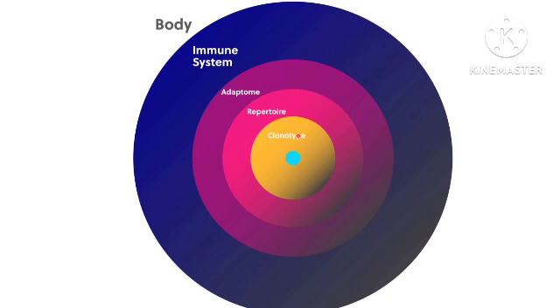So now we are interested in studying clonotypes only. There are other assays which can study the whole immune repertoire by repertoire sequencing, but with clonality we are very much interested to know the clonotype of an individual, to differentiate the clonal population from the polyclonal population based on the clonotype signature, to be specific, the CDR3 signature.